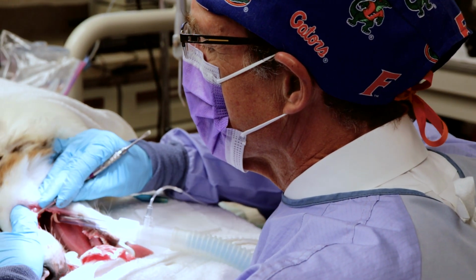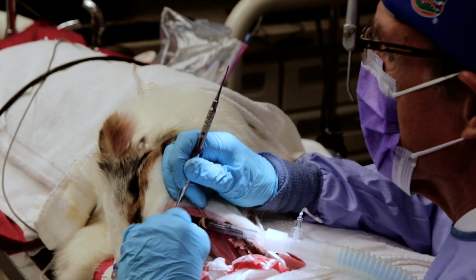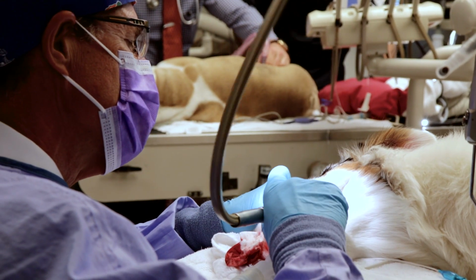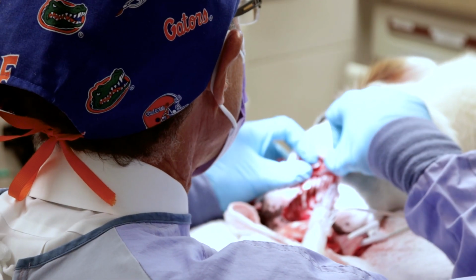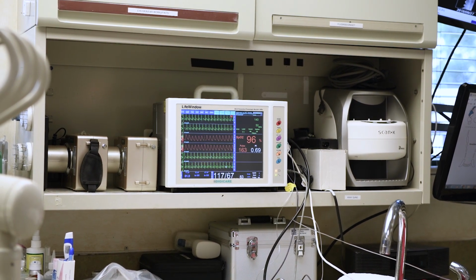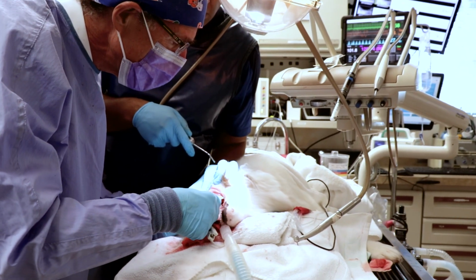Many of our patients are 3, 4, 5, and even 6 hour surgeries, and we do that every week. We have at least 2 or 3 very long surgeries because a lot of our involved cases are jaw surgeries, and we have to take out jaws, and we take dental x-rays and take out multiple teeth or multiple root canals, and it takes a long time. It feels good to look up at the monitor and be able to see that the patient is doing well in all respects. There are so many things on those monitors, and it's just a good feeling as compared to, is he breathing or not, or is the color good or not.